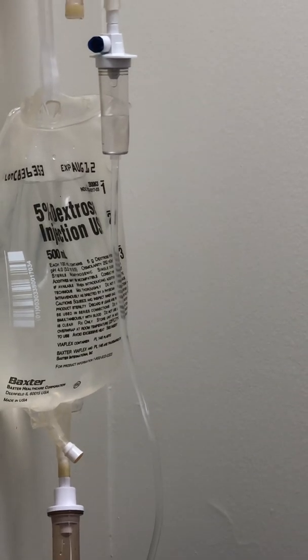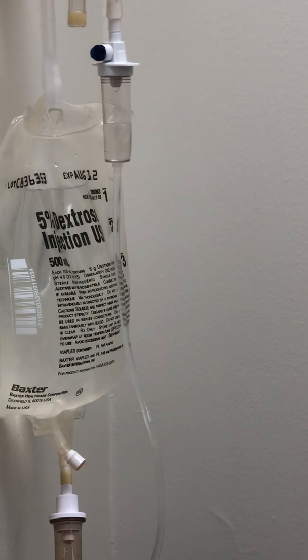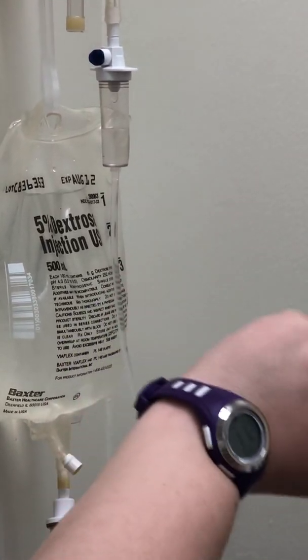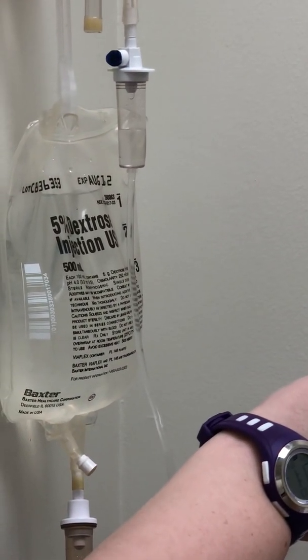So that was 2 drops within 15 seconds. Let's see. You zoom in. Okay. Now I'm gonna start counting my full minute.